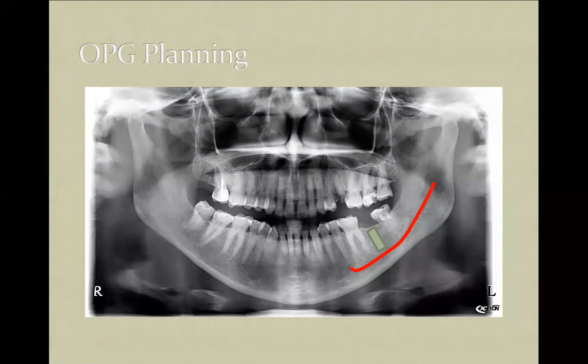So when you're making the diagnosis for the adentia, I think that you can simultaneously pre-plan your surgical procedure. And here, within your surgical procedure, there are two main factors that should be taken into account. First, the site of insertion, where to insert and how to insert.